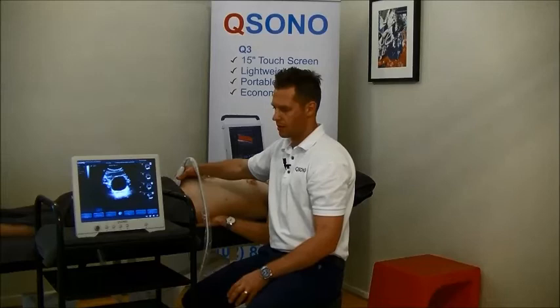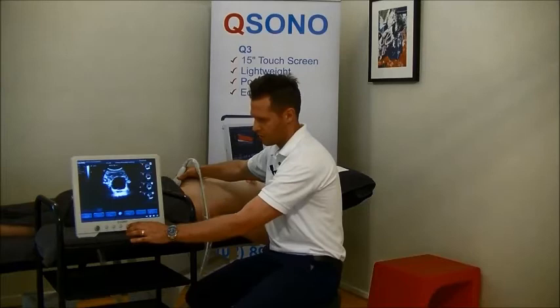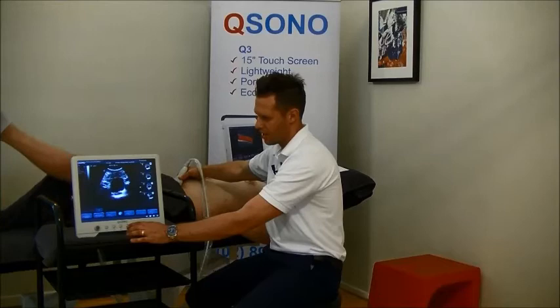And now what I'm going to ask you to do is to see if you can switch on your pelvic floor and maintain a pelvic floor contraction while you're doing that straight leg raise. So whenever you're ready, just switch on your pelvic floor for us and elevate. And come back down and relax everything. Now switch on your pelvic floor again and lift the left leg for us, please. And back down. Fantastic.